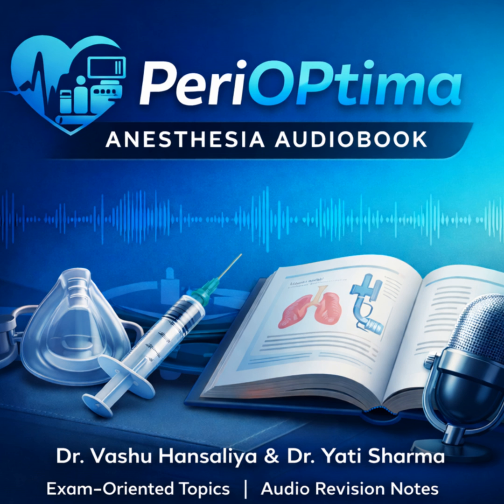And one last basic concept: mandatory versus spontaneous. This one's easy. A mandatory breath is one where the machine is the boss. It's either started by the machine or ended by the machine, or both.